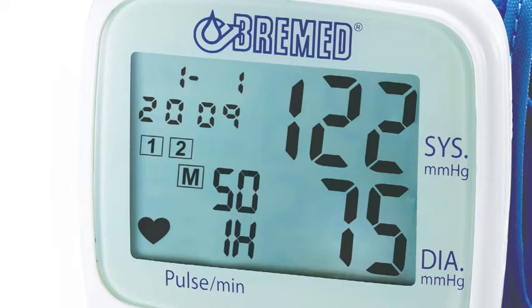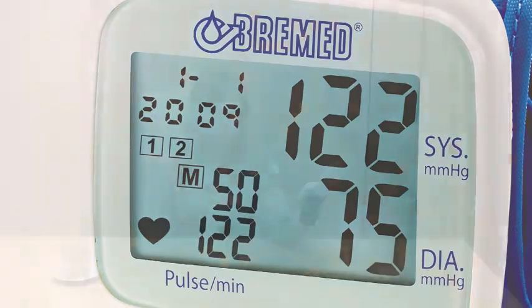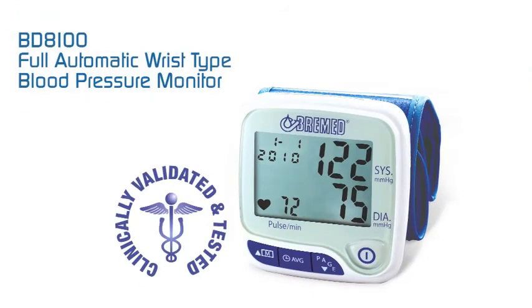Furthermore, the detection system will inform you in case there is any irregularity in your heartbeat, with a special symbol flashing on the display. The Bremit BD-8100 blood pressure monitor — a user-friendly device you should have at home, taking care of your health.